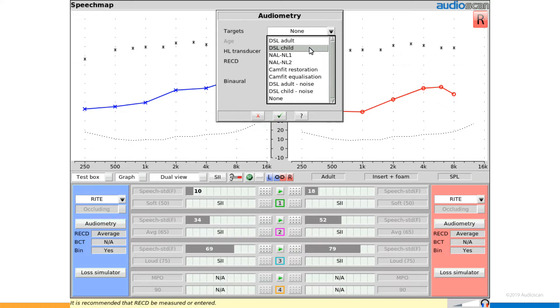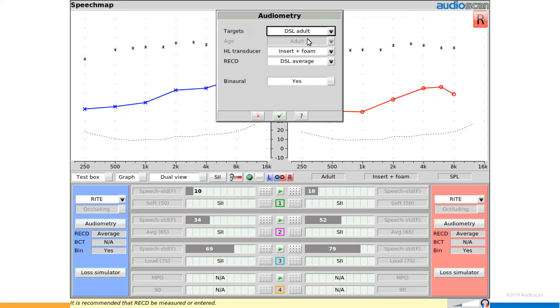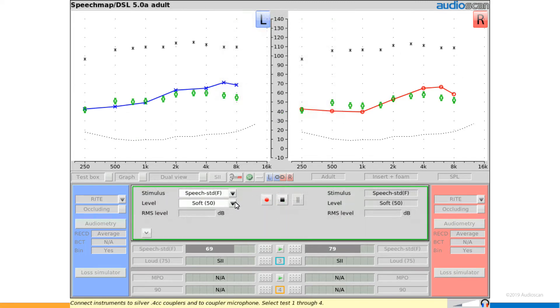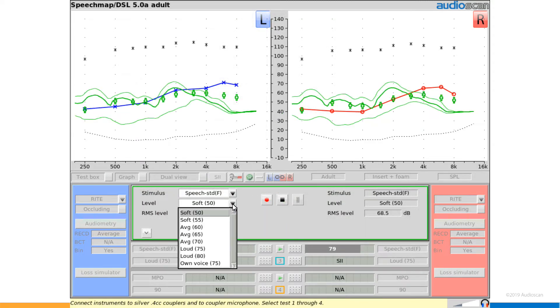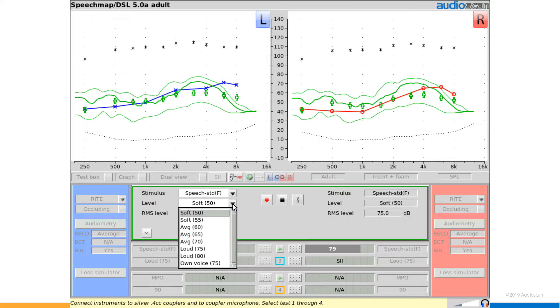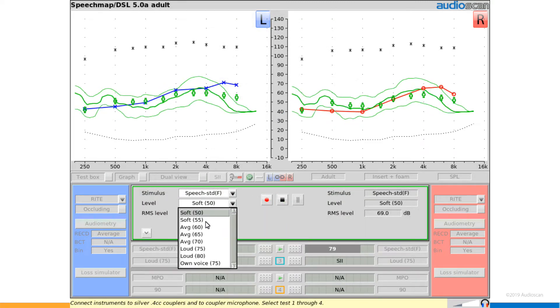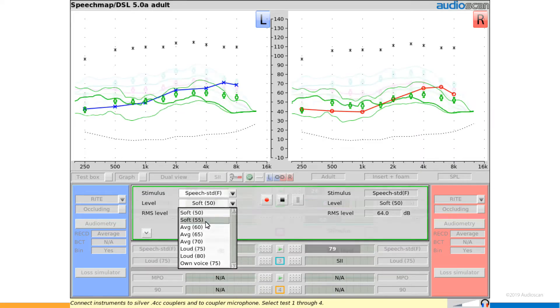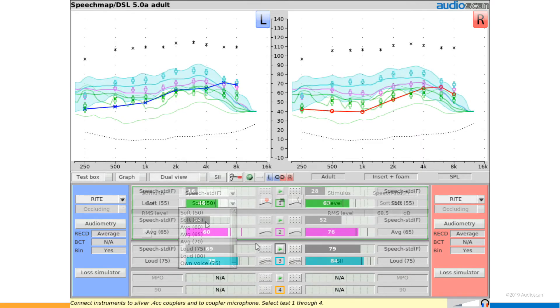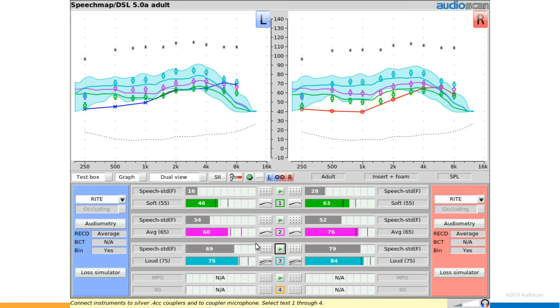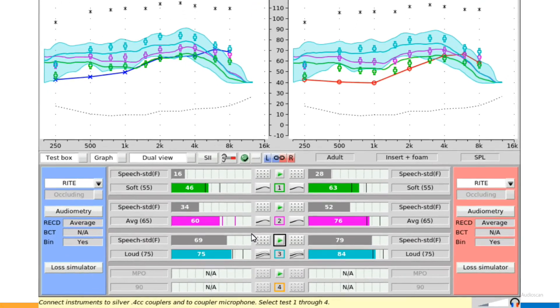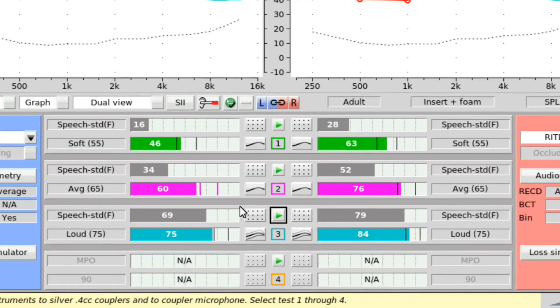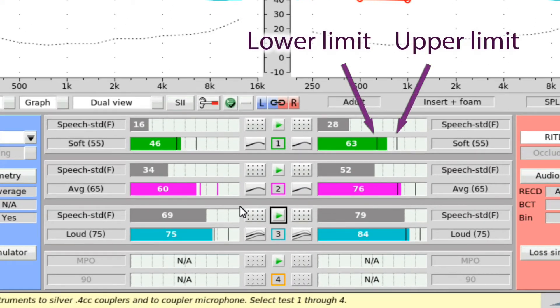In speech map, the rationale must first be set to DSL adult. SII target ranges are available only for 55, 65 and 75 dB test levels. Once tests have been run, note the vertical lines in the aided autobars. These indicate the suggested upper and lower limits for SII for each test, based on the client's pure tone average.